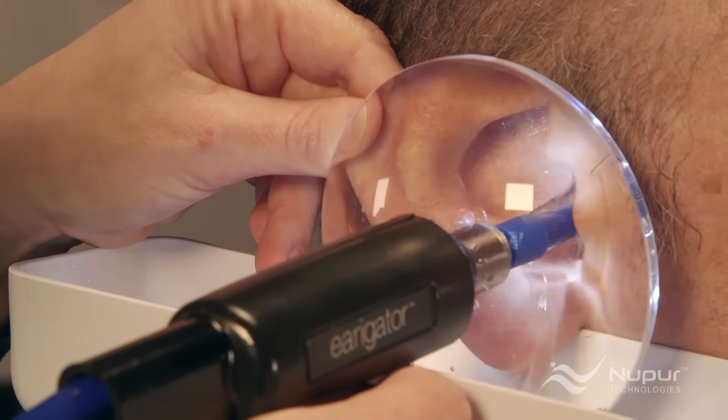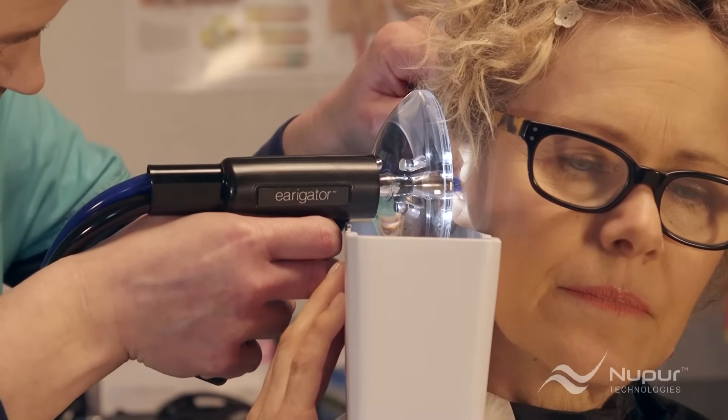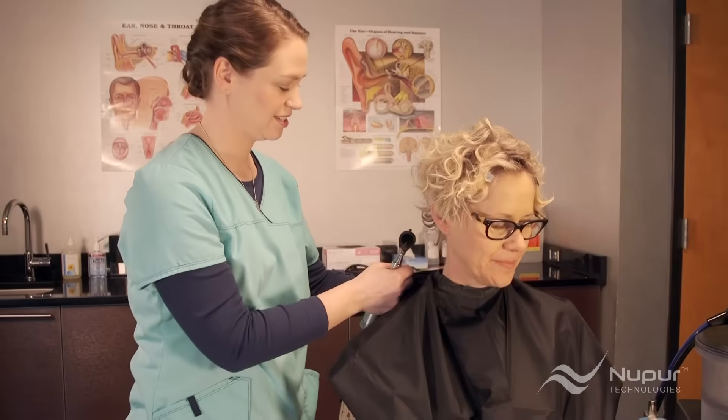Training can be done in less than 10 minutes. The procedure itself can take as little as 15 to 20 seconds per ear, and it's completely safe and pain-free.